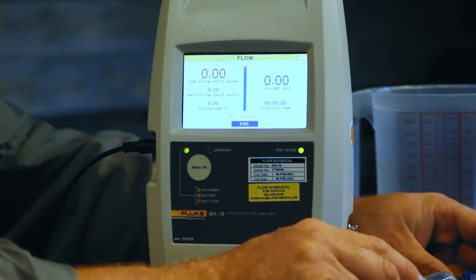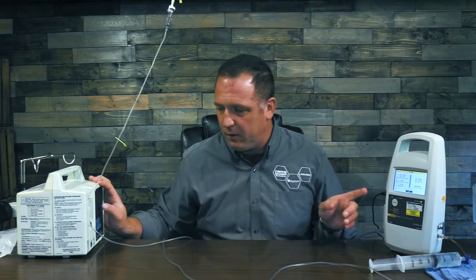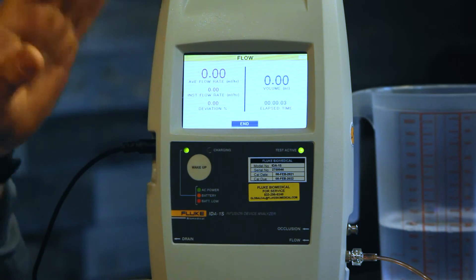The reason I chose auto start is because I'm doing 150 milliliters an hour. If I was going for a small rate — like through a syringe pump, maybe five or 10 milliliters an hour — I would use the manual start. Start here, start here — this started, it sends to flow and this has started. We're going to wait for a few minutes; this is approximately a four minute test and we're going to make sure that it's infusing.